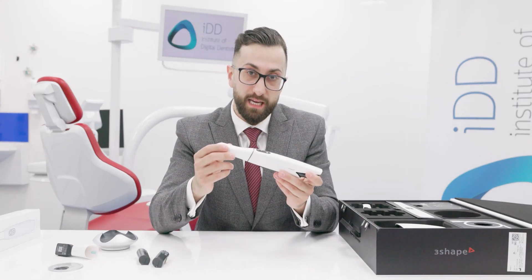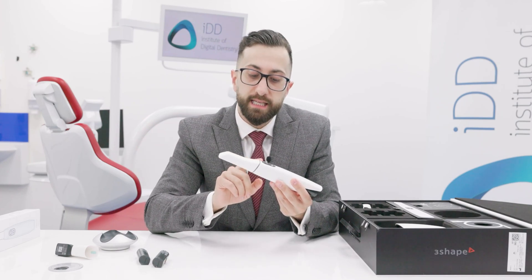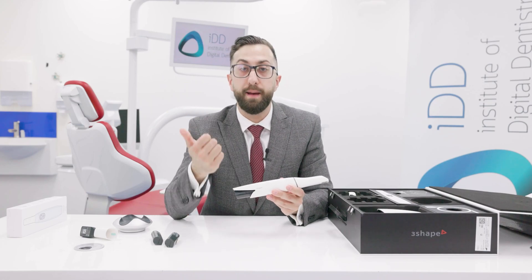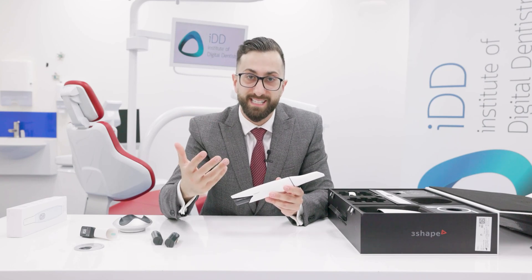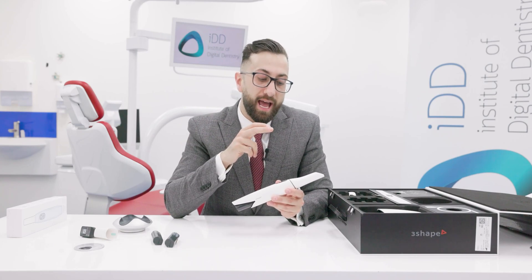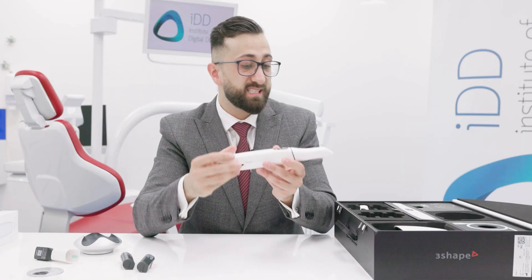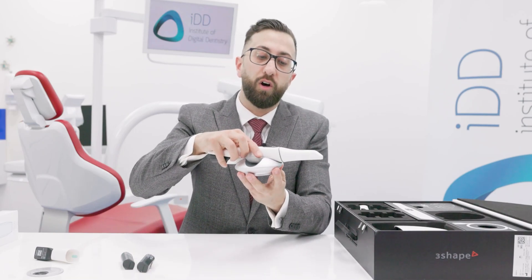One last new addition compared to other Trios models is this LED ring. The company has included haptics and this LED ring in the Trios 5 to give the user as much feedback as possible while scanning. If you're scanning and lose your position, an LED light will come on to indicate that you've lost scanning position. The scanner will also vibrate to give you that feedback. With the battery in place, this is how it fits on the docking station.